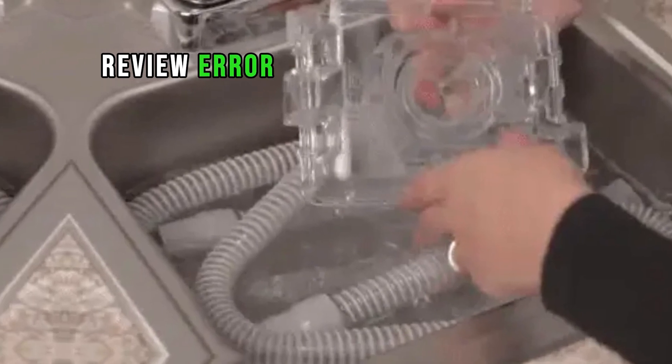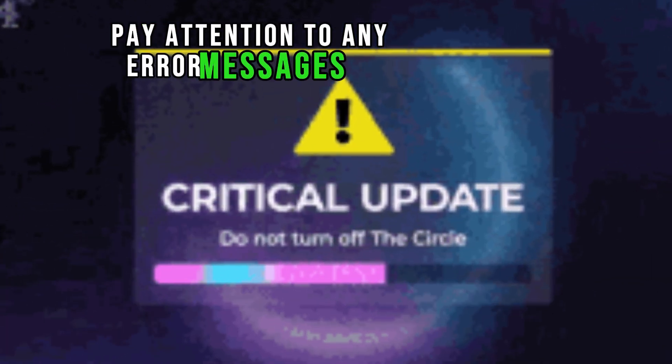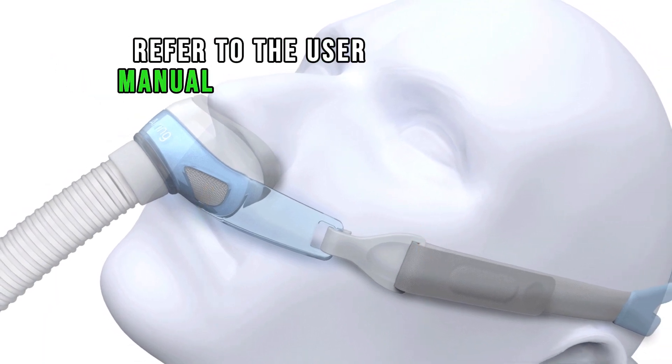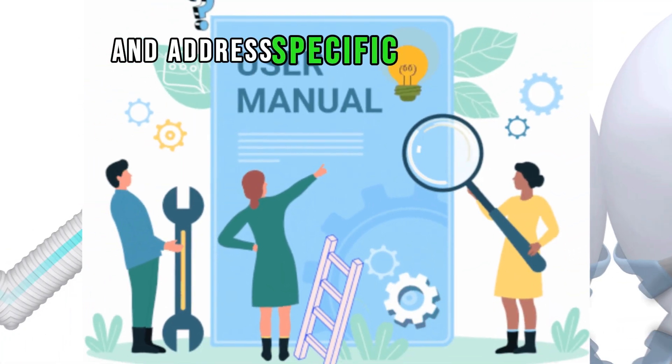Review error messages. Pay attention to any error messages or alarms displayed on the machine. Refer to the user manual to interpret and address specific error codes.